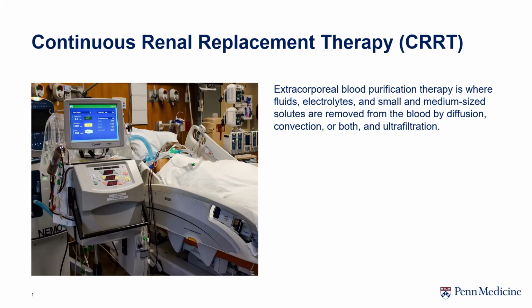I'll be talking about dialysate. I'll also be talking about some of the things that we've learned over the last couple of years, including associating and disassociating the devices. Some of the things I will not be talking about: priming the machine, shooting the machine, or recirculating the machine. I'll be talking about those in later videos.